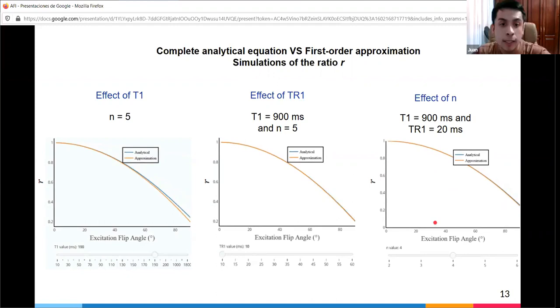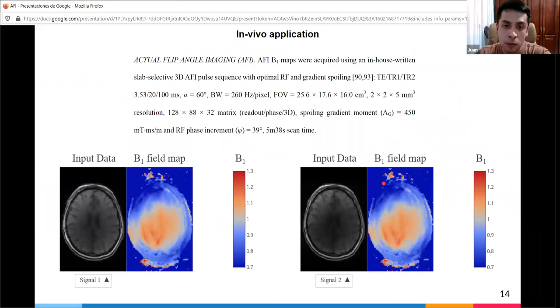Finally, this is an in vivo application. Matthew acquired this data. He shows the input data, signal 1 and signal 2. This is the field map, the B1 field map, calculated as the ratio of the distribution of the actual flip angle to the nominal flip angle, which was set to 60 degrees.